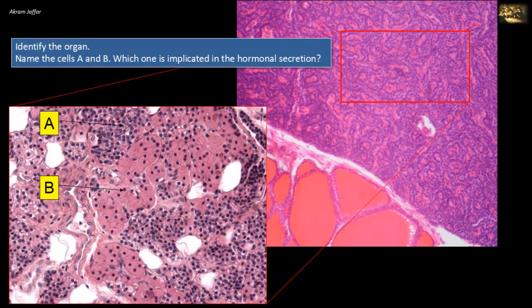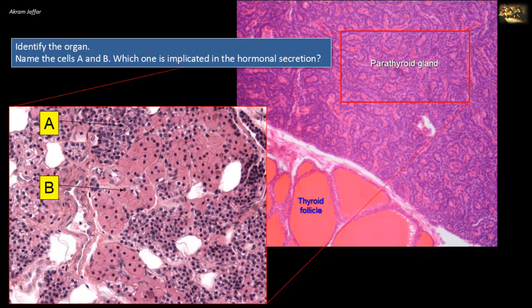Identify the organ, name the cells A and B, and which one is implicated in hormonal secretion. The right section gives the clue: in the lower left-hand corner you can see thyroid follicles, so the adjacent organ is the parathyroid gland. The parathyroid gland contains chief cells, also called principal cells, represented in A. They are small cells with a round, centrally located nucleus, and they synthesize and secrete the parathyroid hormone.